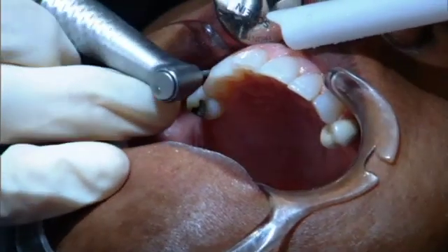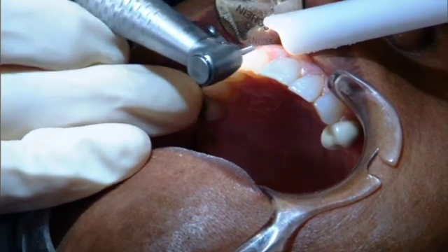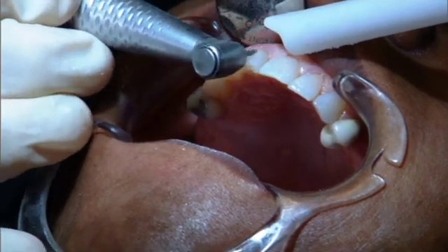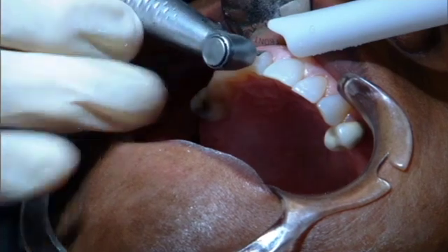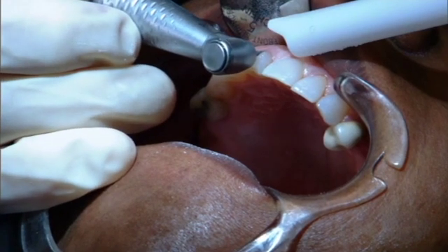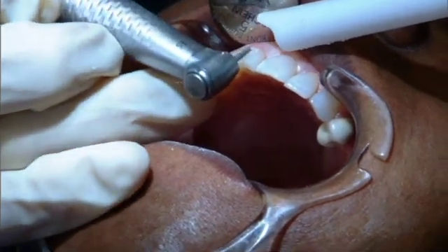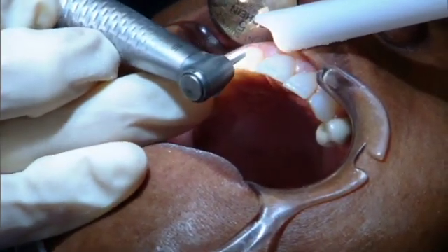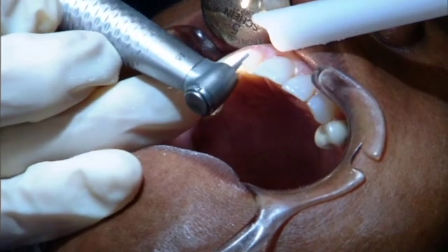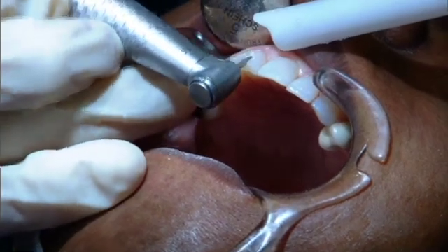After I've done my incisal reduction, then I'll make a depth cut in the gingival 1/3 of the tooth. And Elliot, I don't know if you can see this, but the angle of that handpiece, I am completely to the depth of the burr, which is going to ensure that I have 1.8 millimeters at the gingival. But I also want to get that much reduction in the labial surface, so I'll just extend my depth cut using my burr as a guide out onto the labial. So now I've got two-plane reduction mapped out in the central.